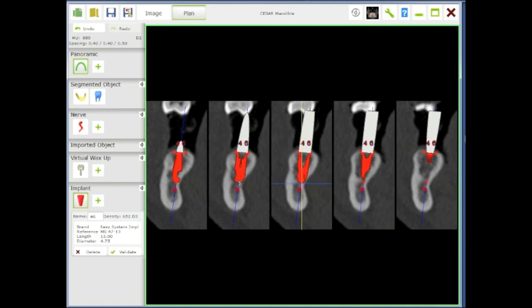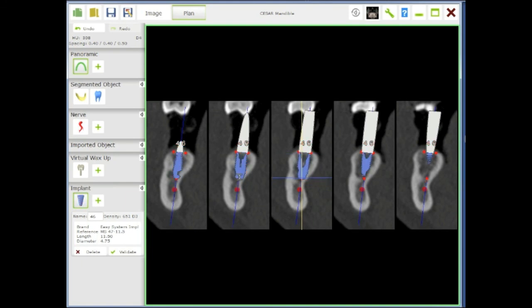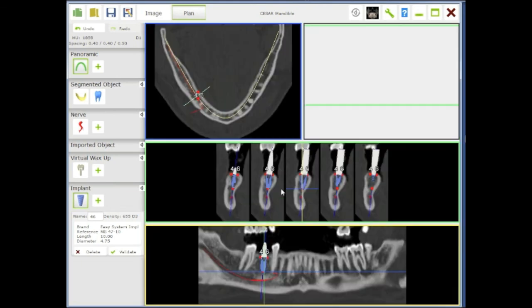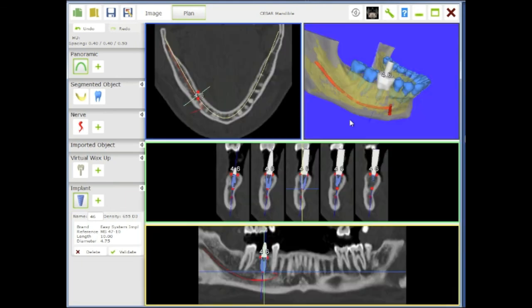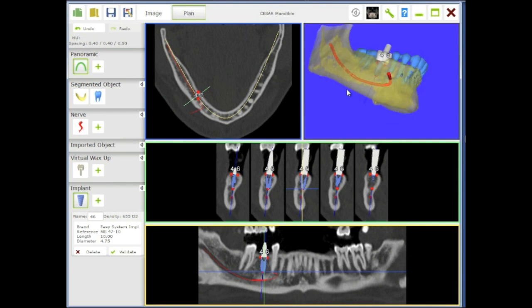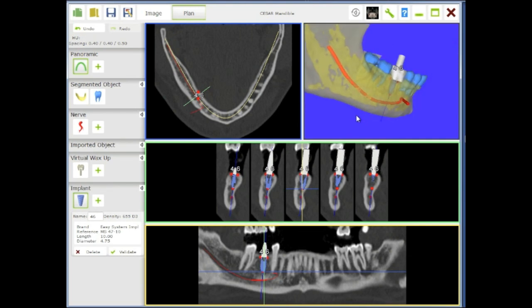You can just go here and also you can increase the length. When you go less than two millimeters to the nerve, then it will show in yellow, in red, and this means that you should not go too far. So in this case we're going to work on a 10 millimeter and 4.75 millimeters in diameter, and the implant is selected and we can go forward to fabricate a surgical guide.